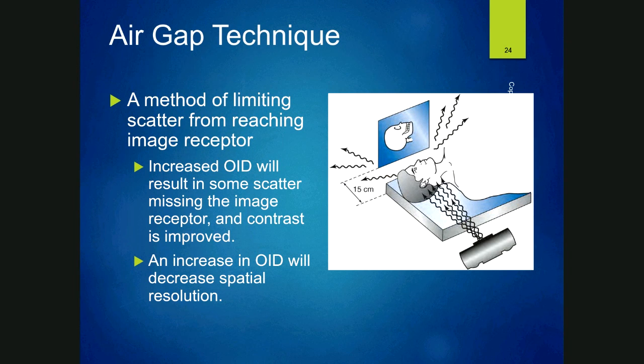The next thing here at the very end of the chapter talks about shielding accessories, and the fact that you can place a lead mat behind your patient, especially in that lateral lumbar spine situation that we just talked about. You can put a piece of lead behind them and it cleans up that scatter. So obviously, if you clean up the scatter, what's going to happen to the visibility of your image? It's going to be increased. It's going to be better. So that's always a good idea.